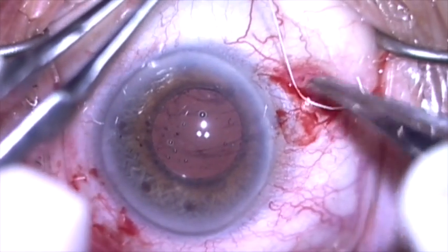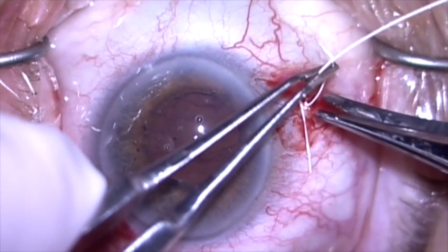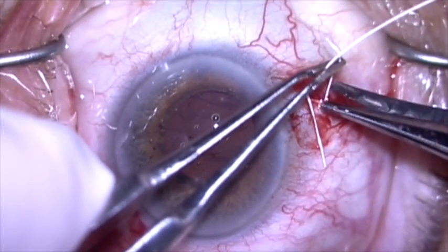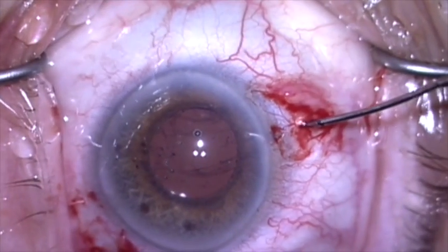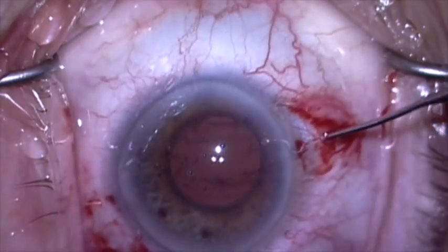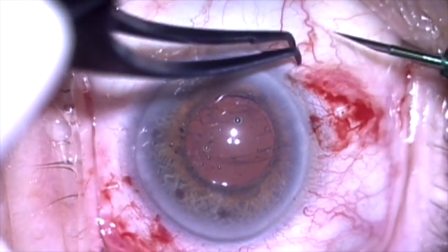I'm now going to lock my suture here and do an extra throw just to be safe. We'll cut this short and then I'm going to use the 25 gauge forceps to push the knot into the eye through the superior sclerotomy. With the knot buried and the suture at the base of the radial groove, this is not going to extrude.